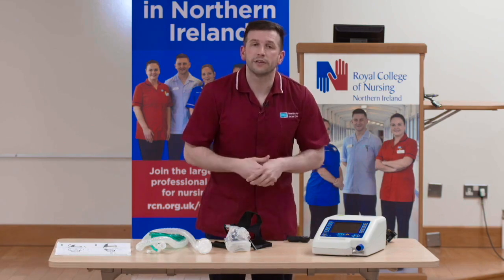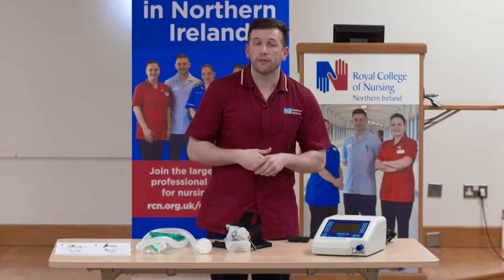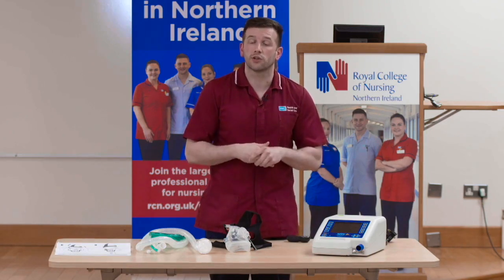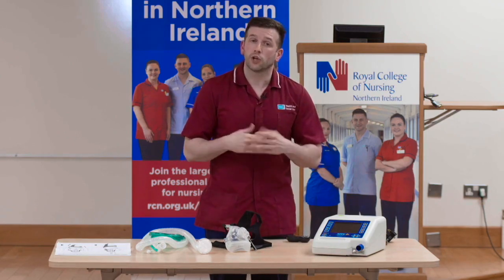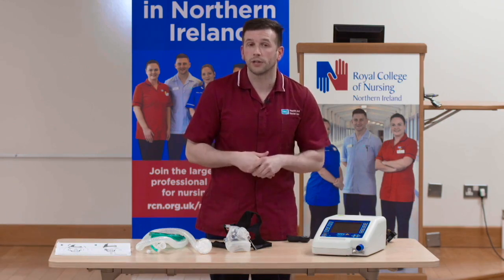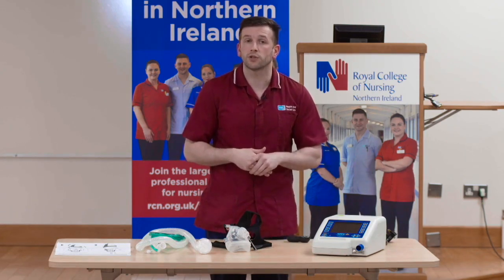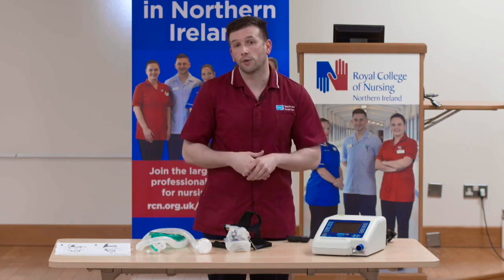Patients who require non-invasive ventilation do need a higher level of supervision, and we would encourage that for the first 24 hours that all of these individuals get continuous pulse oximetry and monitoring that their oxygen saturations are within their prescribed saturation range. We would encourage that they get intermittent monitoring of their pH and their arterial carbon dioxide levels through arterial blood gas monitoring, and we would also encourage they get continuous cardiac monitoring, particularly if their pulse rate is greater than 120 or if they're at risk of developing any arrhythmia or cardiomyopathy.